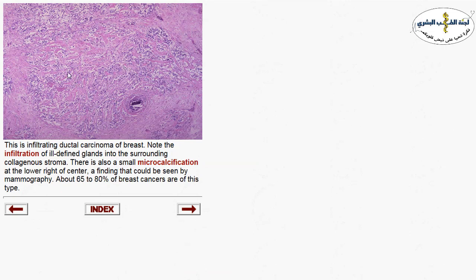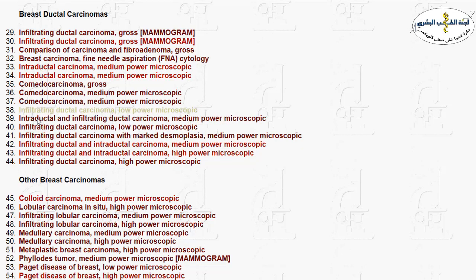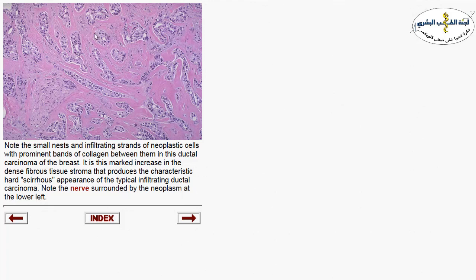In infiltrative malignancy, you can see infiltrative single cells or ducts infiltrating the stroma with stromal reaction — called desmoplasia — which gives the tumor its firmness on cutting surface. The glands are ill-defined, infiltrating within the stroma. Dystrophic calcification — microcalcification — may appear on mammography. Another invasive ductal carcinoma shows the desmoplastic reaction between glands and perineural invasion.